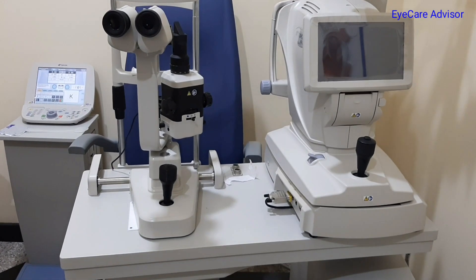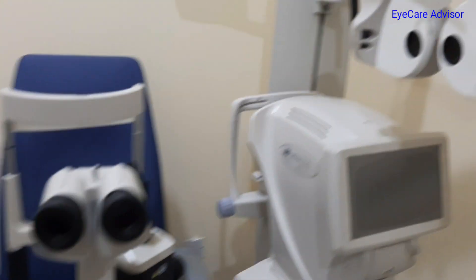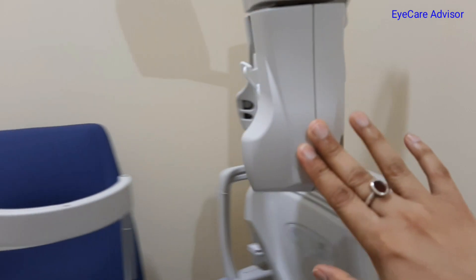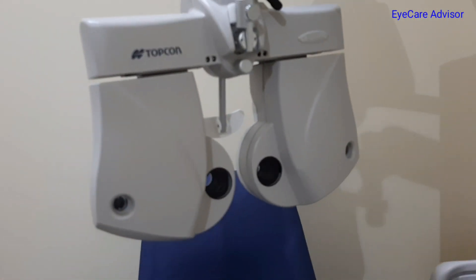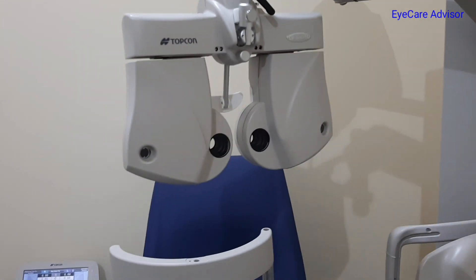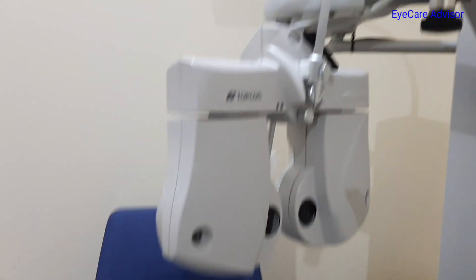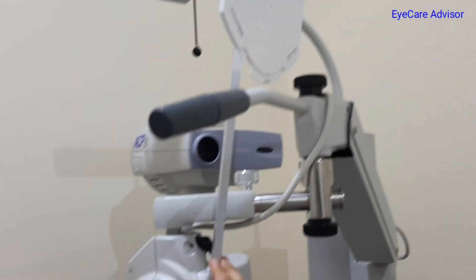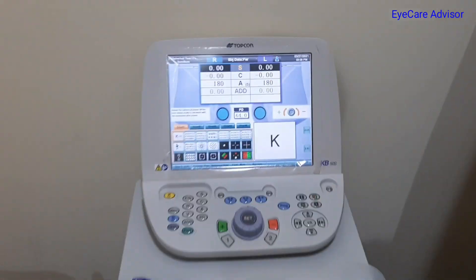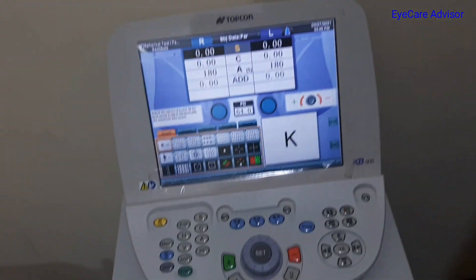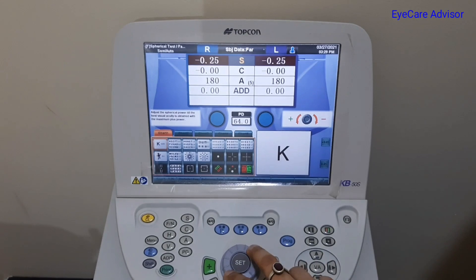Then comes the phoropter — this is the total digital phoropter, also from Topcon. There is a reading chart here as well, and this is where you control it — you can control the full system from here.